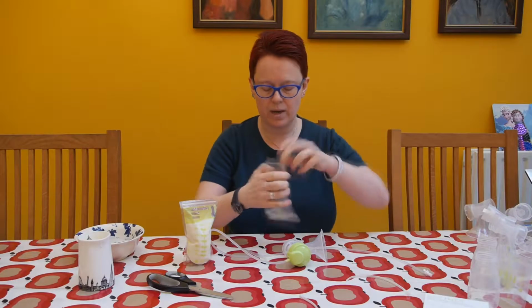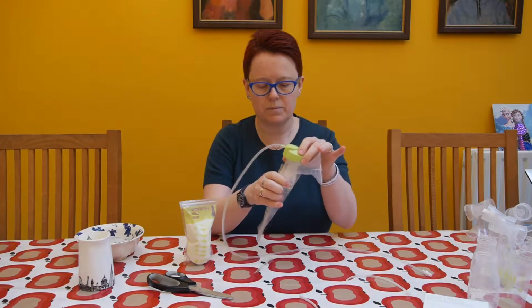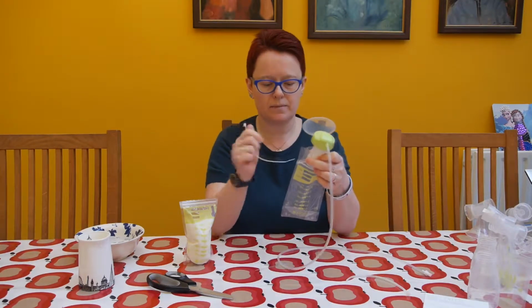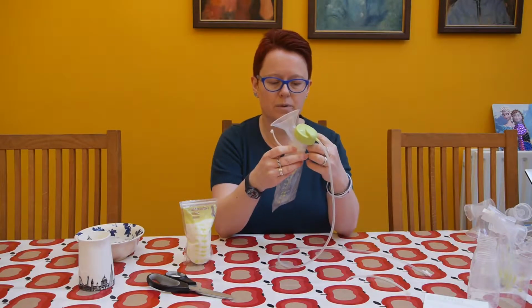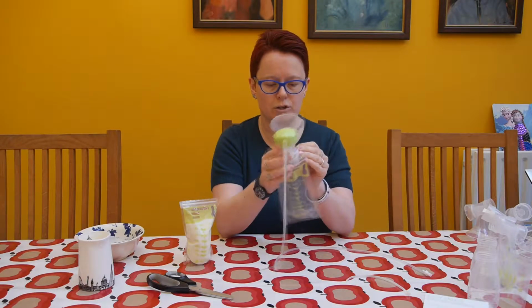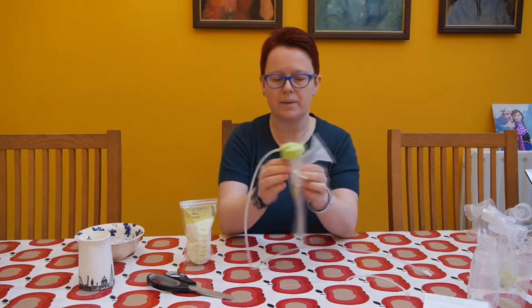I've got nice clean hands before I do any pumping or handling the bag. So I'm going to slip that onto the bottom of the shell. Then I'm going to use one of these cable ties. We've got some pre-cut holes around the top of the Easy Freeze bag. So I'm going to put the cable tie through those pre-cut holes, and then I'm going to tighten it. So we've got that nice tight seal that we need for pumping.